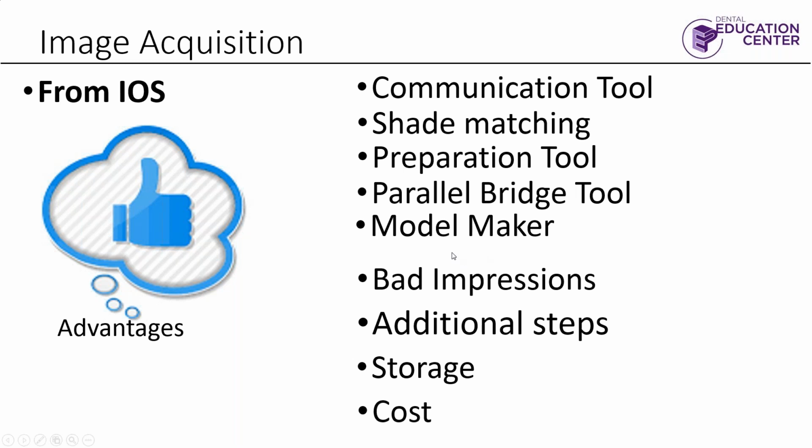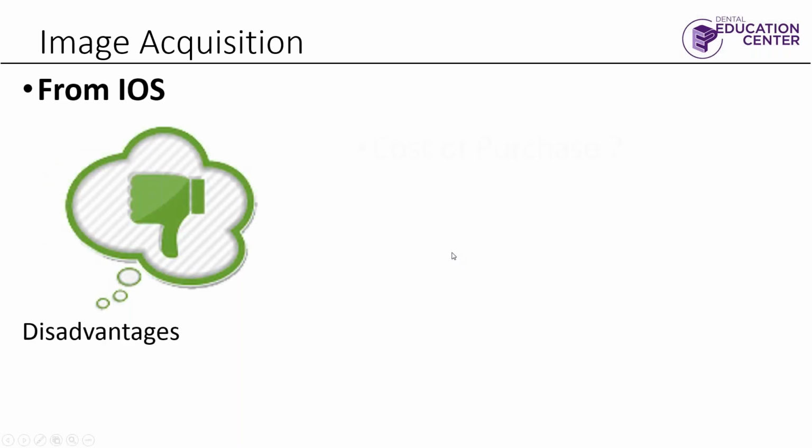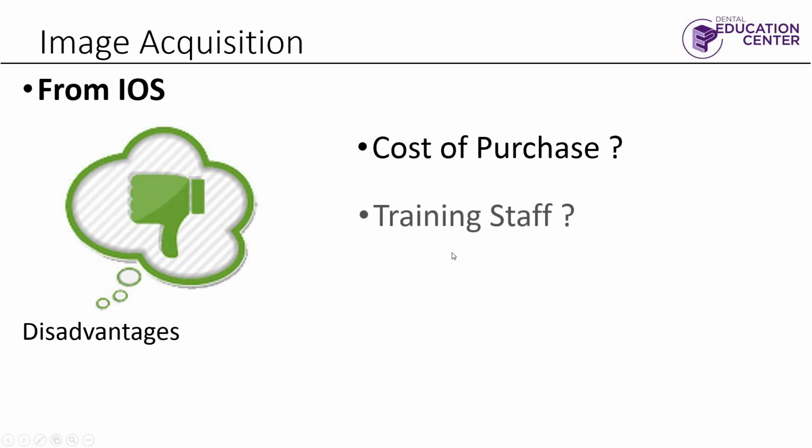Additional steps, storage costs, I think we went into that. Disadvantages, there's a cost to this technology. So you really have to look and see, does it fit into my workflow? Will it pay off?